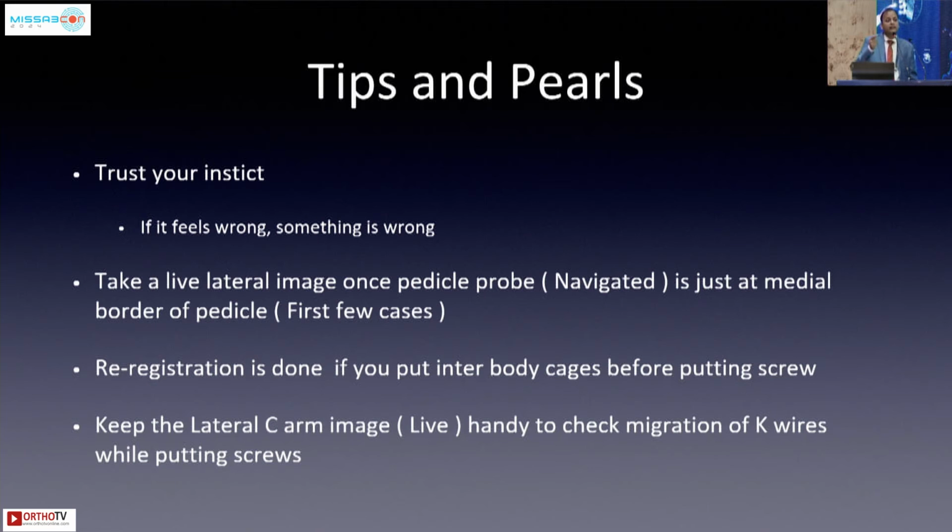Re-registration done. If you have done a T-lift first, always register again, because once you've done the T-lift, it's not the same. The cage expands the disc space. Then again, you have to shoot one blank AP and lateral.